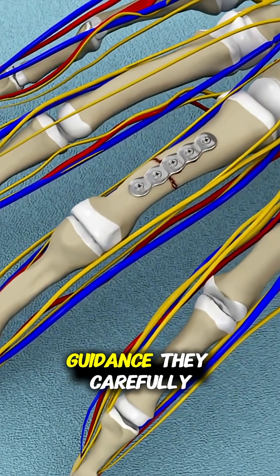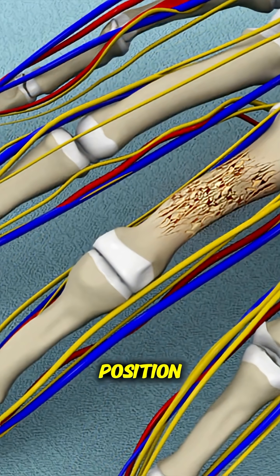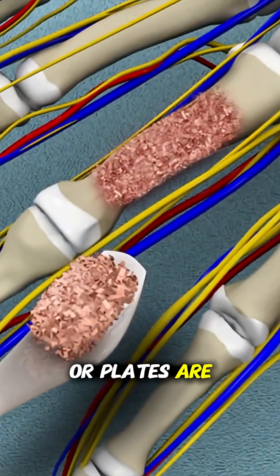Using X-ray guidance, they carefully realign the fractured pieces to their correct position. To hold the bone fragments together while they heal, tiny pins, screws, or plates are inserted.